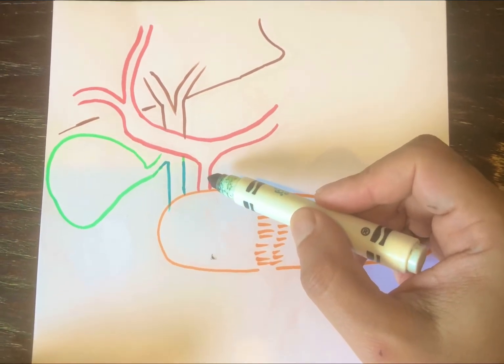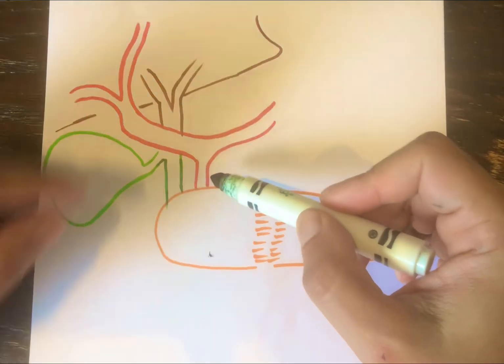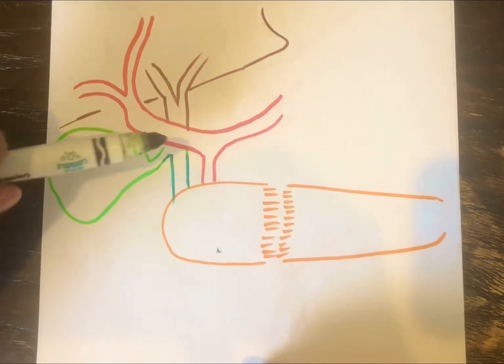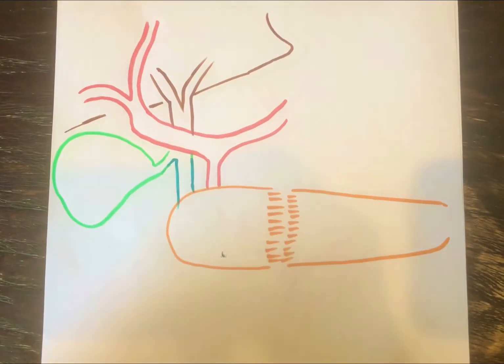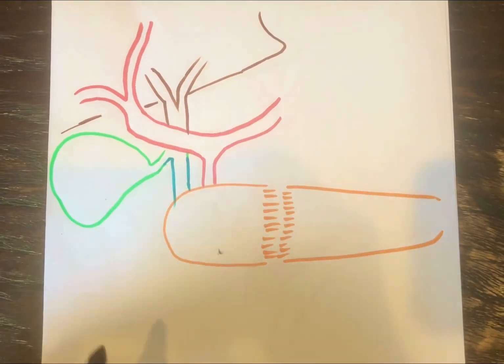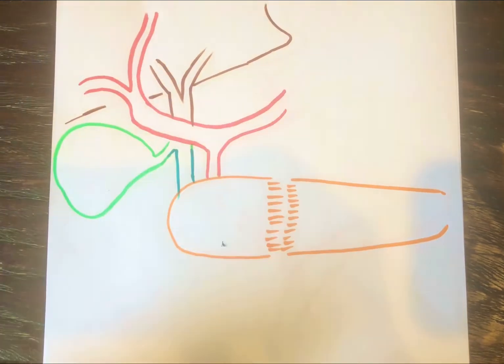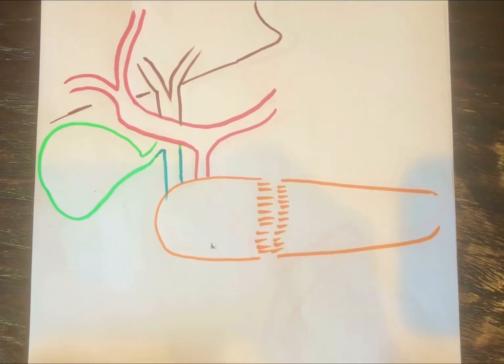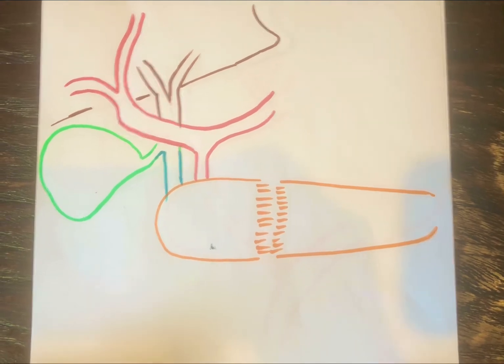Why do you have to confirm it? Because based on your dissection, you may be dissecting up here or you may be dissecting up here. So when you are dissecting up here, you won't be getting a signal up there. That's why you have to make sure that you are dissecting the gastroduodenal artery and you're not on the hepatic artery per se.